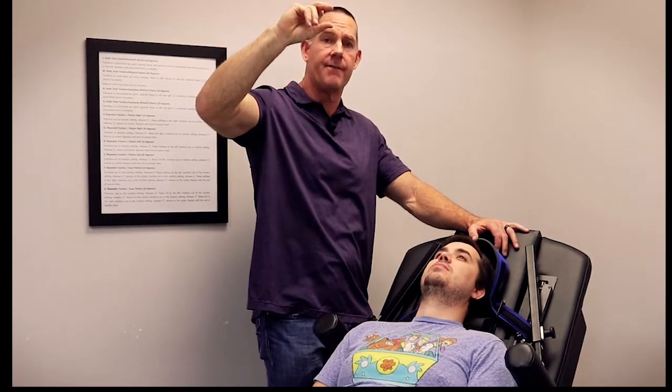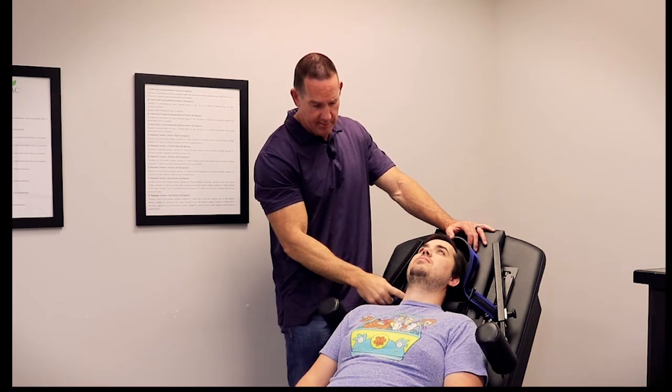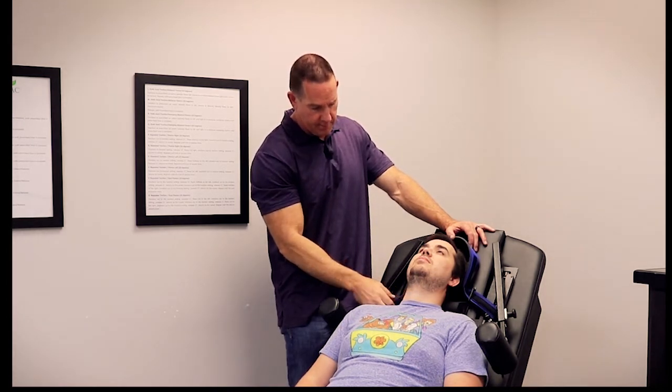If you think of the apex of the cervical curve, it's not up at C4 — it's actually down around C5, a little lower in the cervical curve. So that's what we want: this sitting around C5 so it's put on correctly.